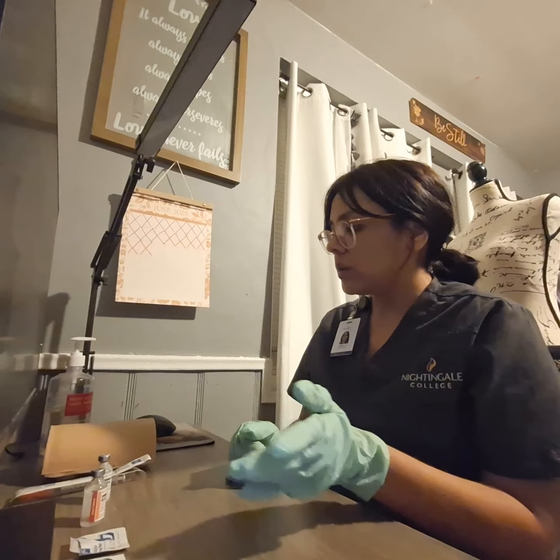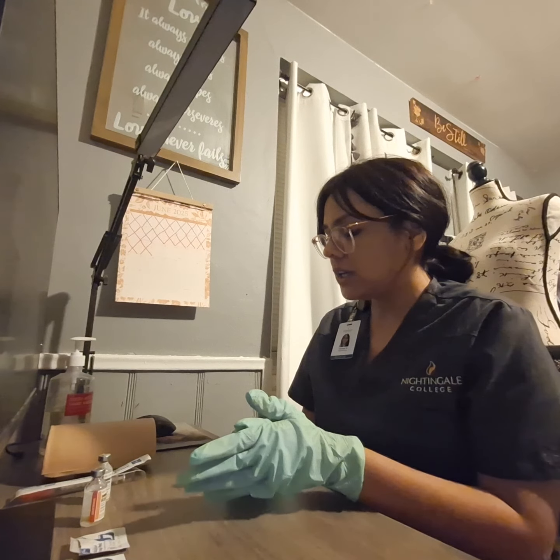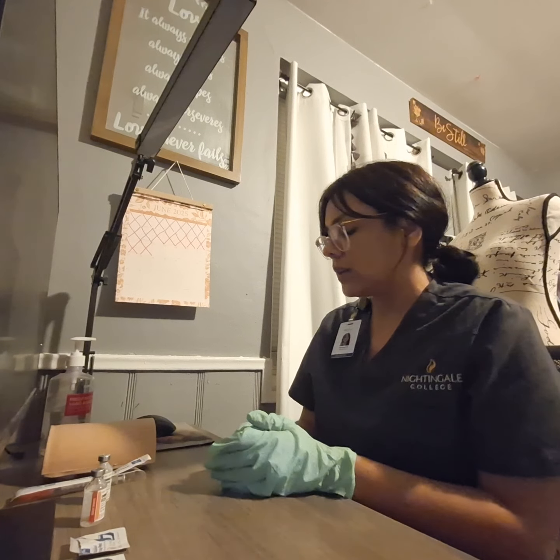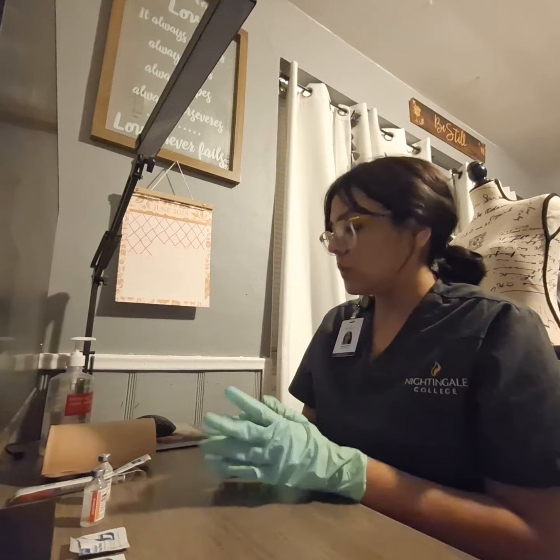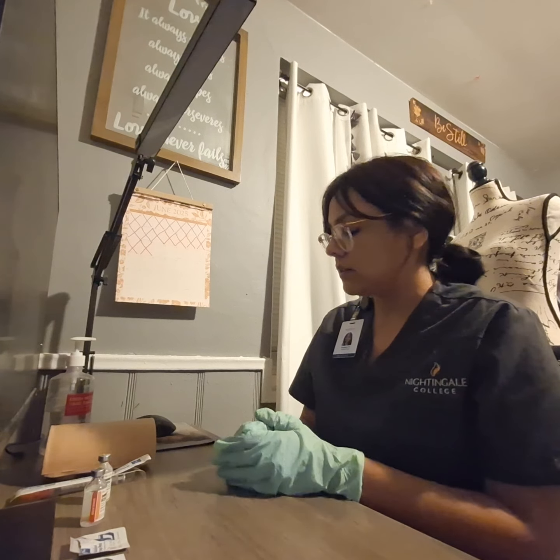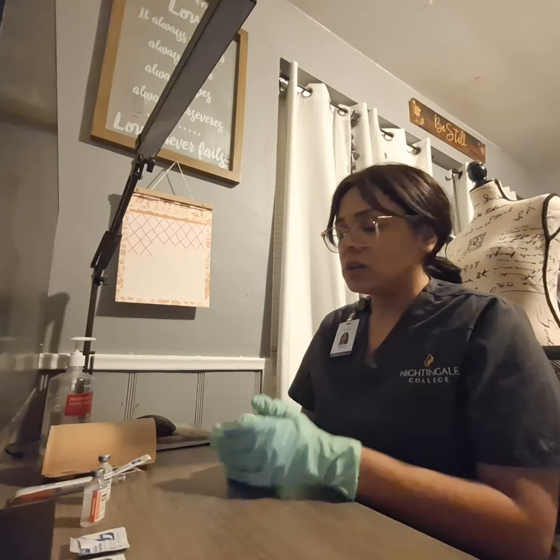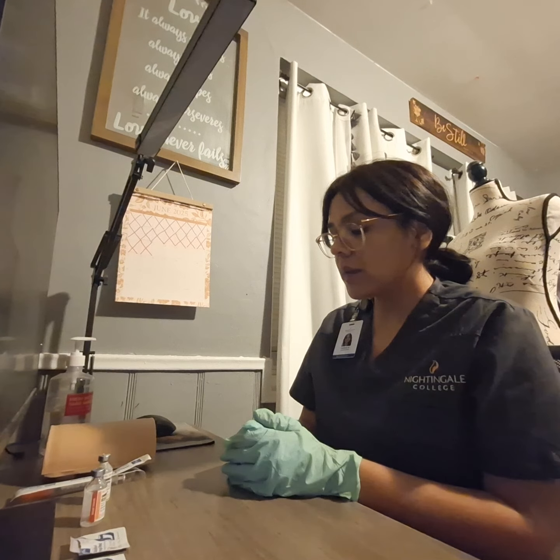I'll ask one of the nurses to come in and verify the medication calculations. The doctor has ordered 4 units of regular insulin and 8 units of NPH. When you add that up, you get 12 units of total volume of insulin. So I also asked the nurse to verify that those numbers are correct.